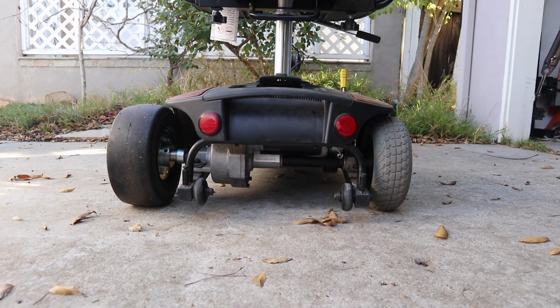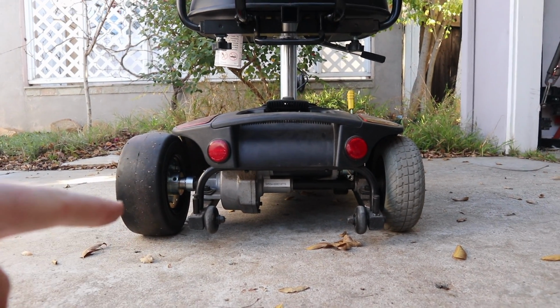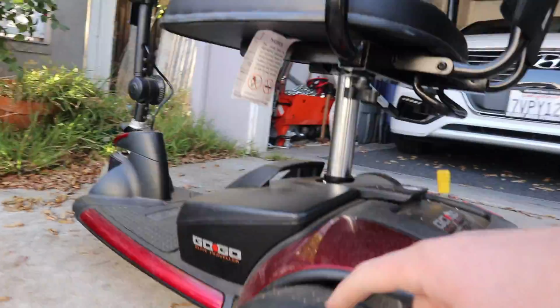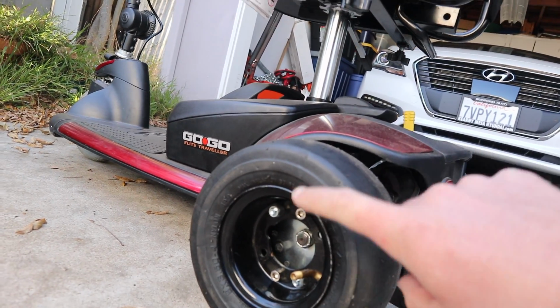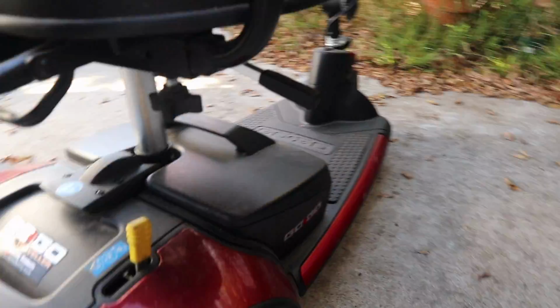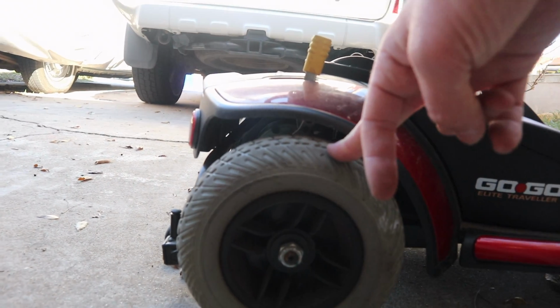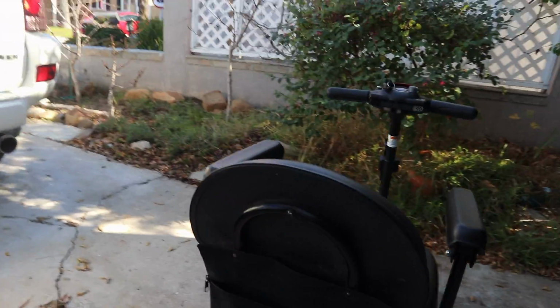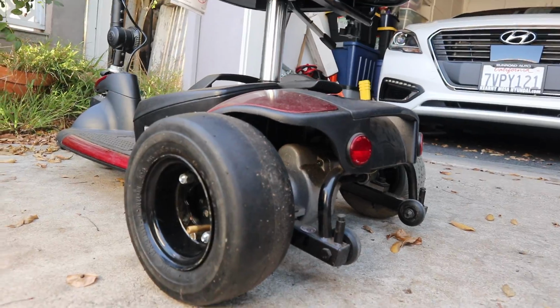I'm holding it flat, and you can see that there's more lift on this side for sure than this one. The diameter of this wheel at full PSI is 8 inches, and I believe this tire is only 7 inches. So you have a full inch more, and that really could make a difference. So that's something to take into account. I want to test that, but I know we don't have time for that in today's video. We'll go ahead and swap the other side and see how it looks.